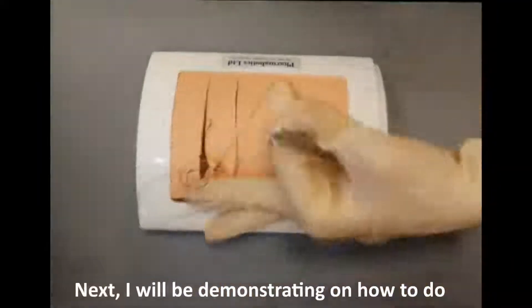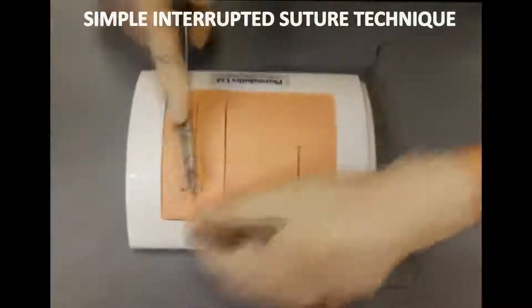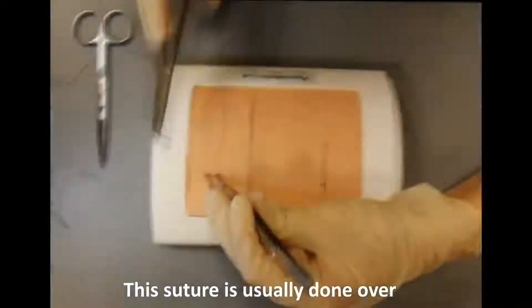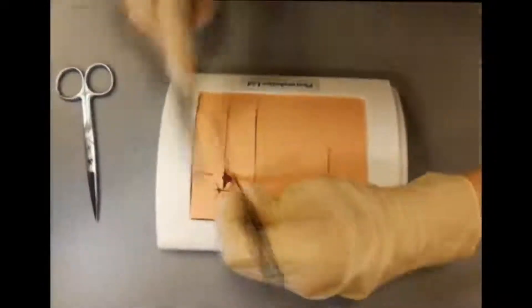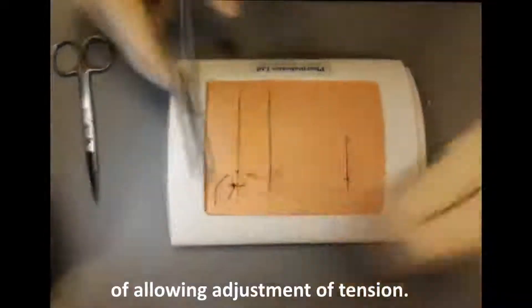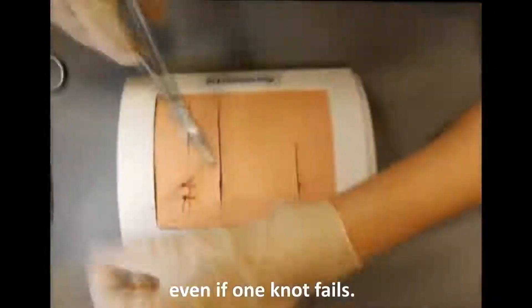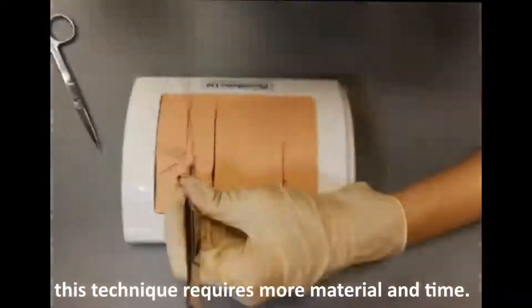Now, I will be demonstrating on how to do a simple interrupted suture technique. This suture is usually done over the perineum muscles and also the skin. The suture has the advantage of allowing adjustment of tension and the rest of the suture will be unaffected even if one knot fails. However, this technique requires more material and time.